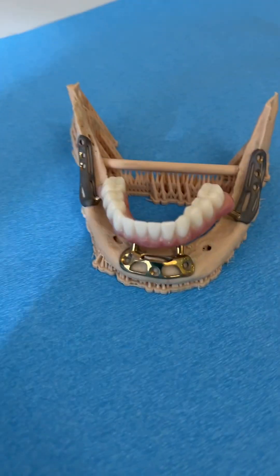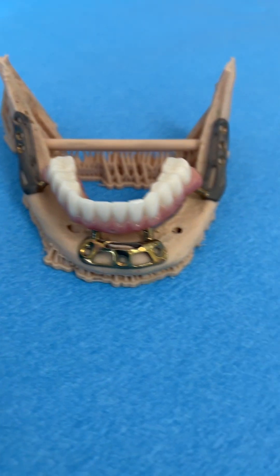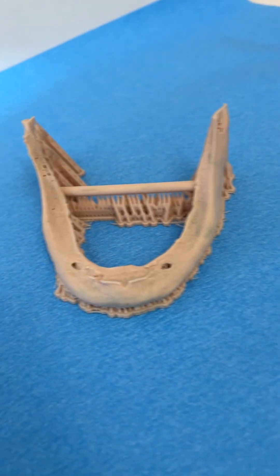Most people have never seen one of these before, so here's your chance to look at it before it goes in tomorrow. This is what it looks like all put together before it goes into the patient. A subperiosteal implant is a custom implant that goes on top of the bone.